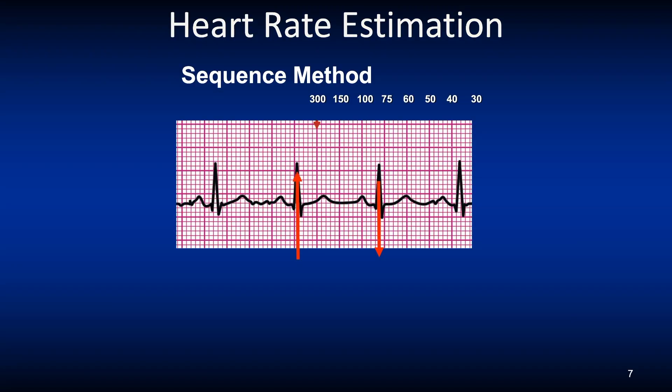Let's look at a way to quickly approximate a heart rate, which is a useful tool in an emergency situation or during an ACLS or PALS course. To use the sequence method, you need to memorize the rate intervals: 300, 150, 100, 75, 60, 50, 40, 30. This method estimates the heart rate. There are other methods and tools available and we'll review others later in this presentation. This method does not require a 3 or 6-second strip and can be used easily at the bedside.